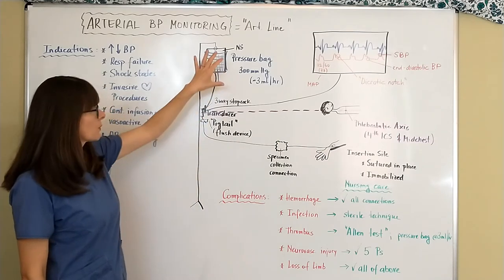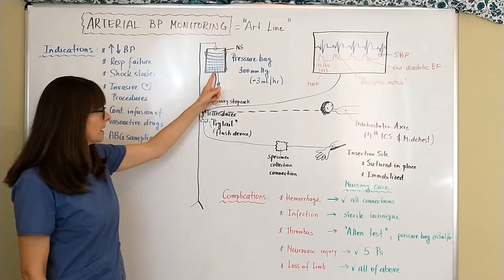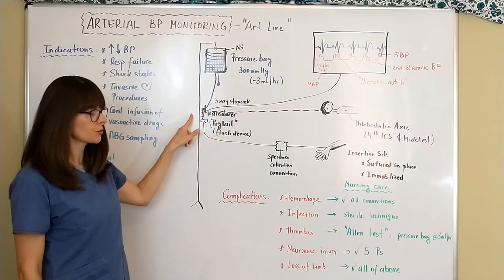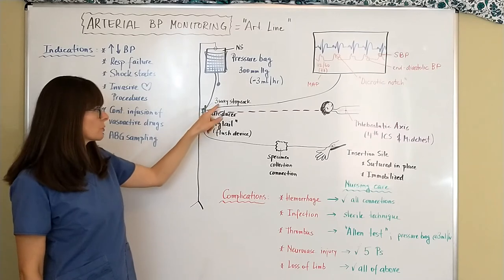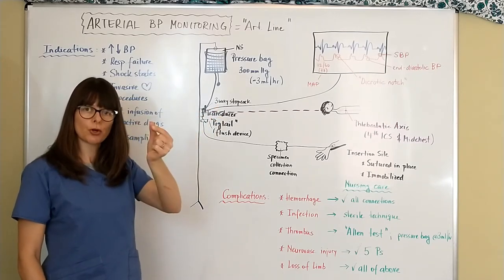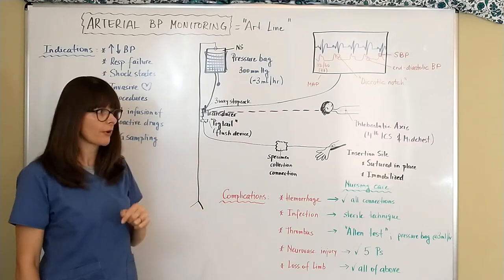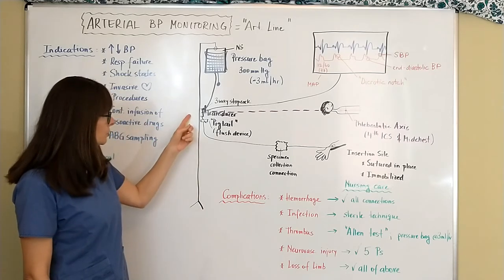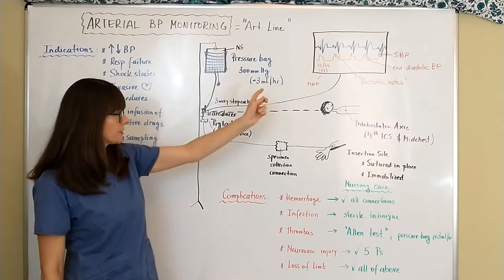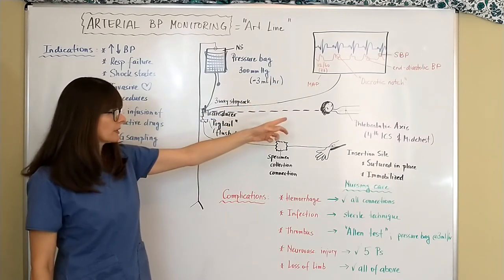And that is because eventually it will end up in the patient's radial artery and I'll go through the parts of this. So first we have this pressurized normal saline, then the tubing goes down here to what's called a transducer and right above the transducer there is a three-way stopcock that'll allow you to turn the line off in three different directions.